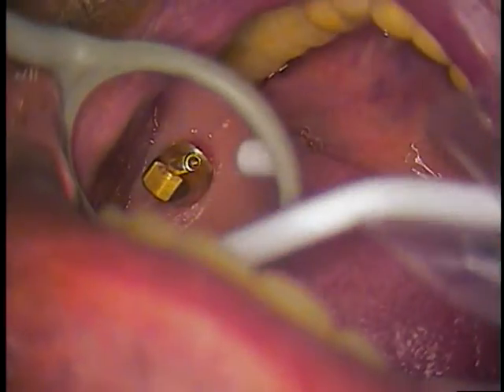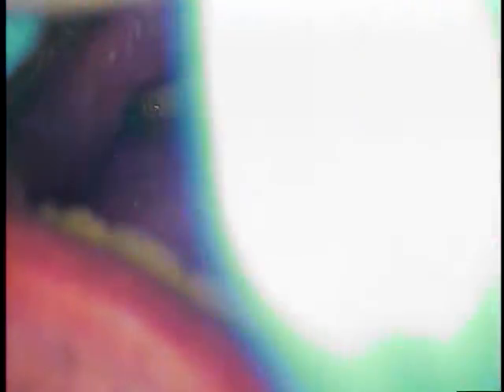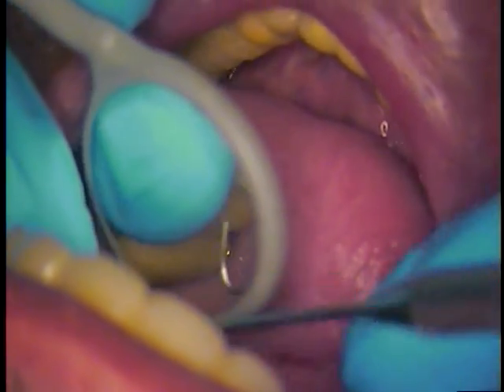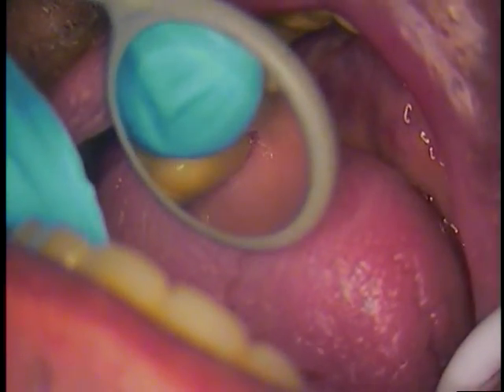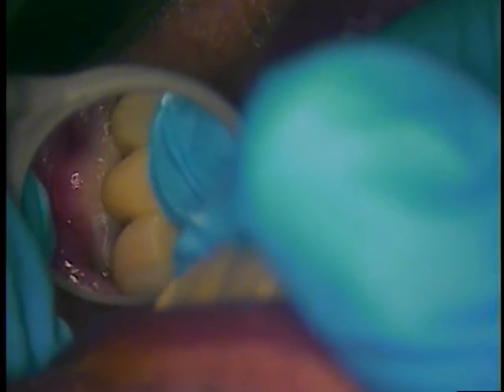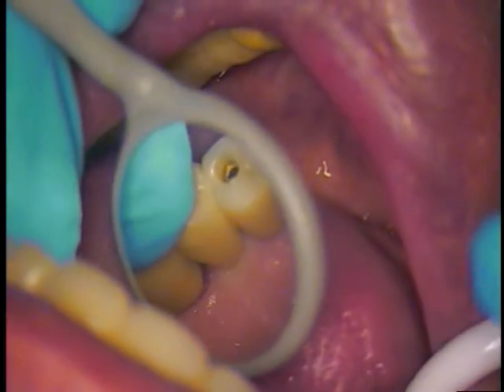We dry that off. Now we've got the implants in the right position and we're going to try in our bridgework. The first thing I want to do is check margins — I'll use an explorer for that. If it's also tight, I'll be checking with floss. The color is perfect. We're also checking the pontic as well. Margins are perfect, and I see that on the lingual. Now we're going to check contact. Looks like we've got good contact. I'm going to lift up the tissue area and check the blanching there — that looks perfect on the pontic. Perfect embrasures. We've got a little bit of blanching going on — that's what we want to see. Contacts are good.